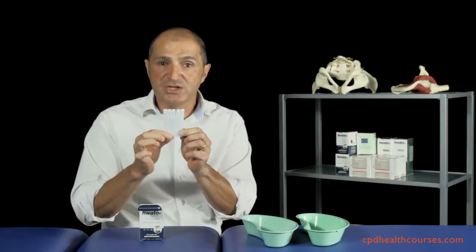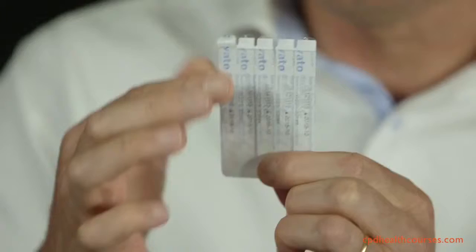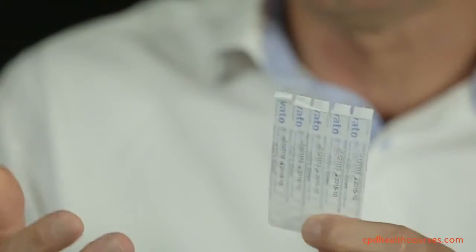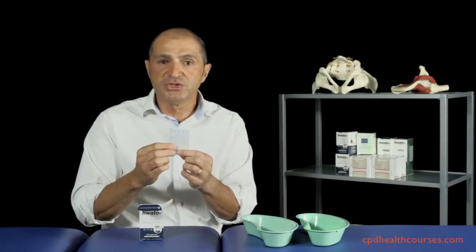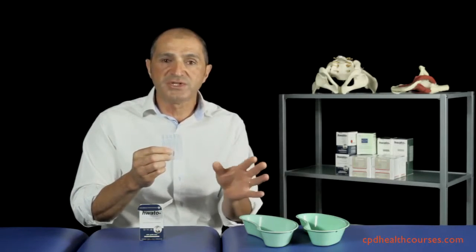This is the last chance for you to find out what gauge the needle is, the dimensions of the needles. So once you take them out of the blister pack, you can no longer tell what type of needle that is. So it's really important to make sure that when you place the needles in your kidney dish ready for use, you keep all the same dimensions in one kidney dish.